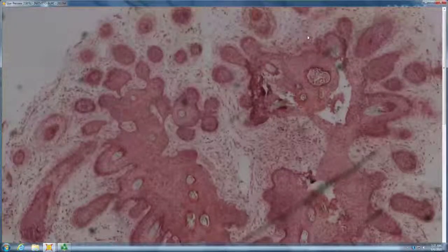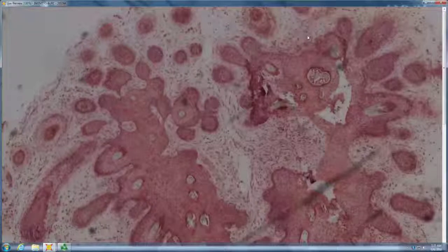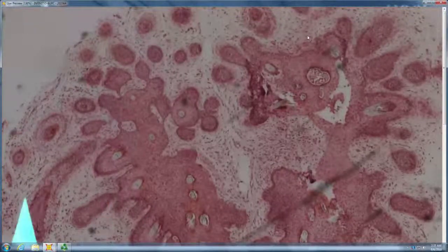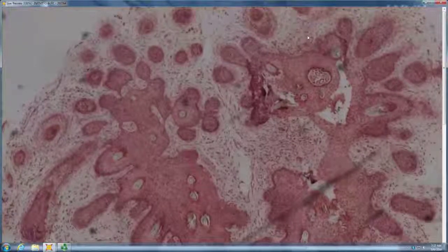Is this trichofolliculoma? It is a trichofolliculoma. So you have to recognize trichofolliculoma when it's cut vertically, and you have to recognize it when it's cut tangentially, right? So this is a tangential cut, and you have all the little babies radiating inward, but it's just a horizontal cut rather than a vertical cut. Well done, but it didn't fool you. You did just fine.